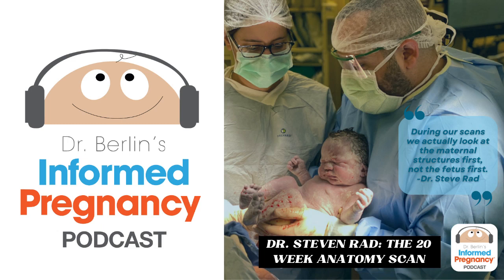Okay. Next, this protocol should be typically universal when it comes to fetal specialists. So the next thing you would look at is the placenta location. You look at whether it's anterior, posterior, low-lying, or there's a placenta previa. And then at the placenta, you want to look at where the umbilical cord is coming out of the placenta, what we call the umbilical cord placental insertion site.